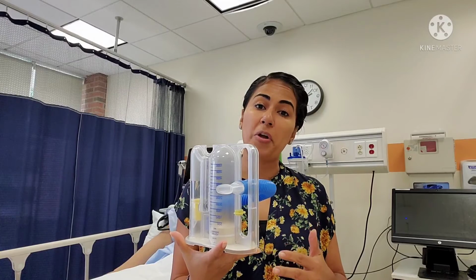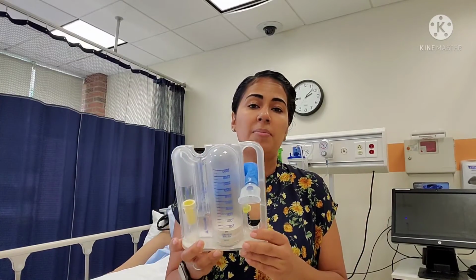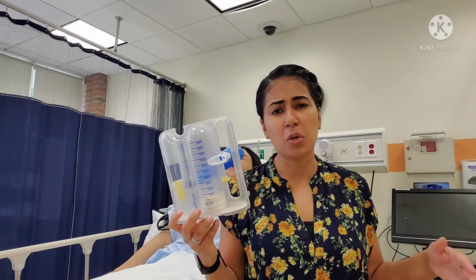Incentive spirometer is very important on this patient, and it's often ordered every hour, depending on your facility, depending on your provider's order. Typically, you want to encourage your patient to use it about how many times an hour? In all the facilities that I've ever worked with, we always encourage our patients to use this at least 10 times every hour if they can, and that's where the pain management is so important.